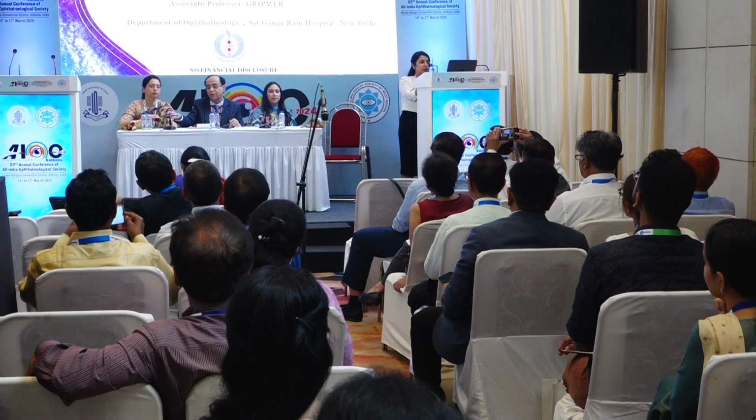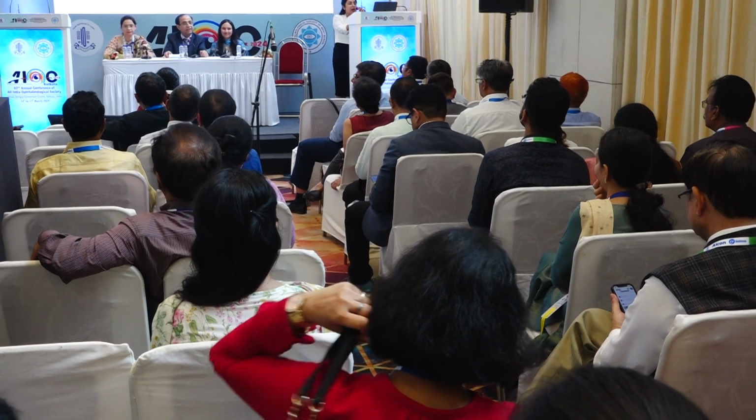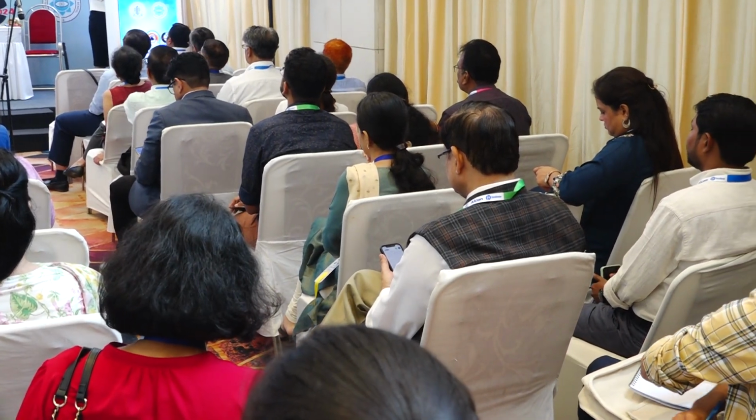Good afternoon, everyone. Thank you for joining us and thank you for the opportunity. So I will be talking about the power modulation in phaco emulsification. As we know, the phaco machine has a lot of functions, and their interrelationship is called the phaco dynamics. There are two main functions. One is the ultrasonic power, which I'm going to talk about today, and the other is irrigation aspiration, which is the safe suction of the emulsified material.